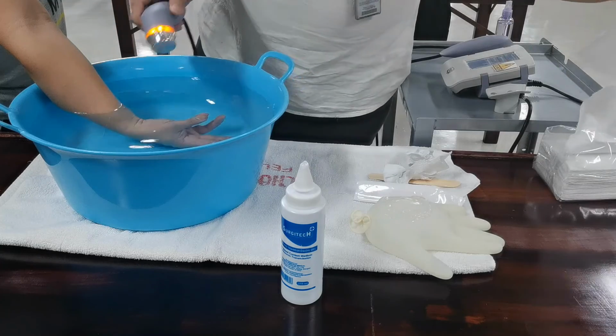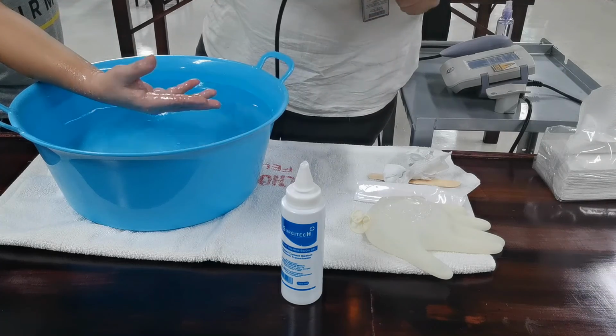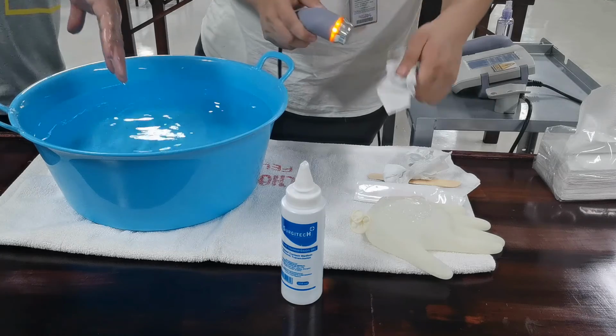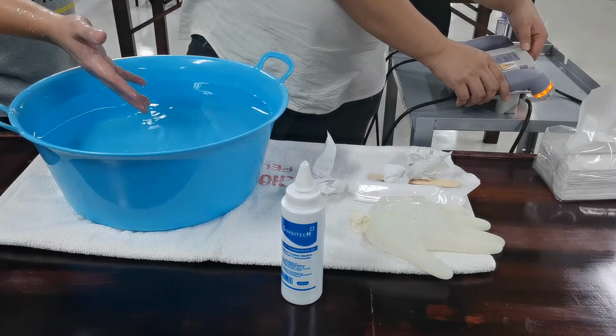For example, the treatment is done. In this case, the patient should be in a seated position, and the level of the basin is on the lap of the patient so that they don't need to flex their wrist.